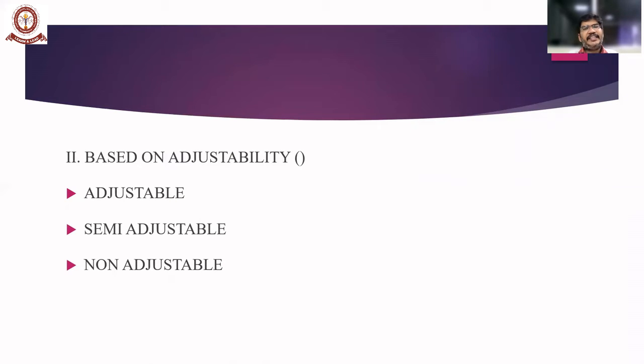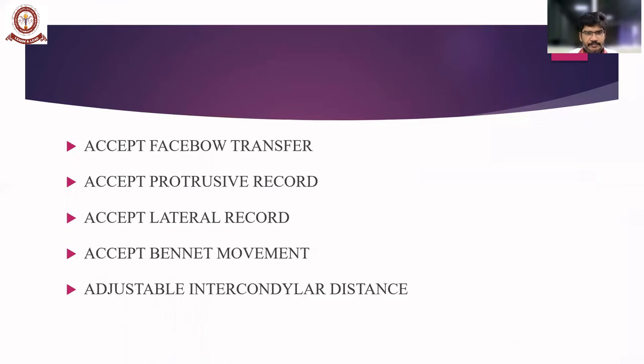Second, based on the adjustability, it can be classified into adjustable, semi-adjustable, and non-adjustable. So it should accept face bow transfer, it accepts protrusive record, lateral record, and Bennett movement. It also has an adjustable condylar guidance.